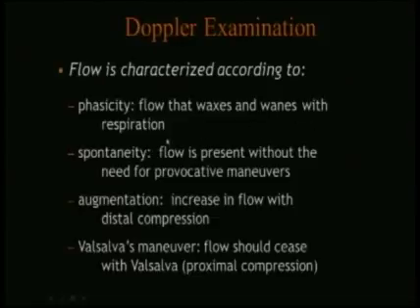With deep breaths, the flow should cease, and with resuming of normal breathing, the flow should resume. Flow at the level of the common femoral vein should also be spontaneous, and that is that you should not have to perform any provocative maneuvers to elicit flow at that level. If you're having to do that, especially when it's a unilateral issue, you need to be clued into the potential for an issue.